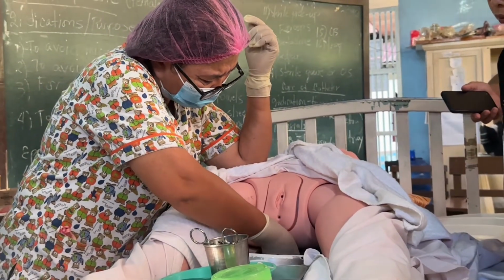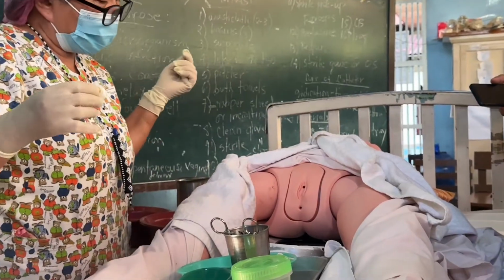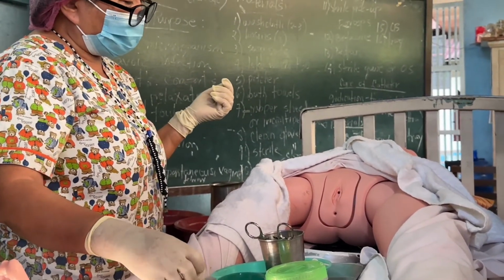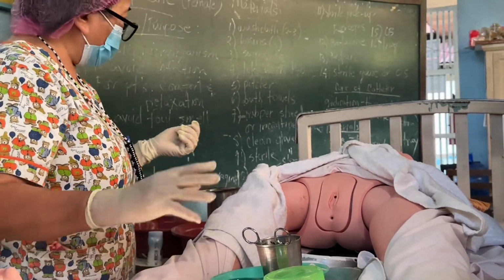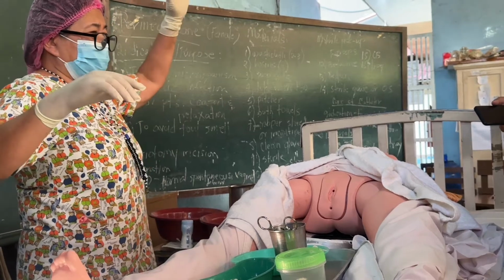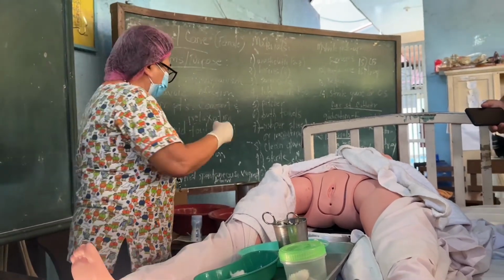Okay, you now clean. Then I'm done. I'm now going to pour with lukewarm water. Okay, this is my contaminated hand. This is my remaining sterile glove hand.